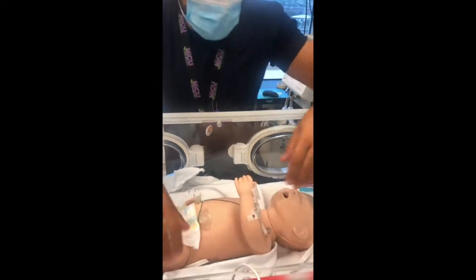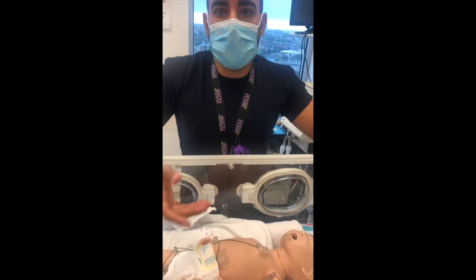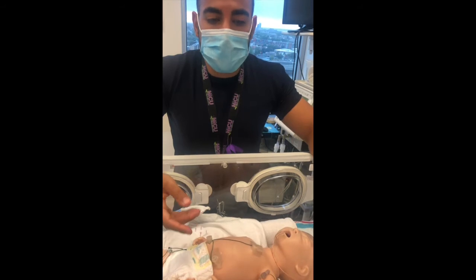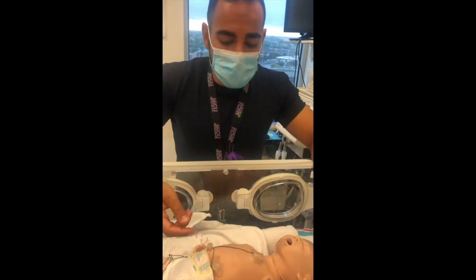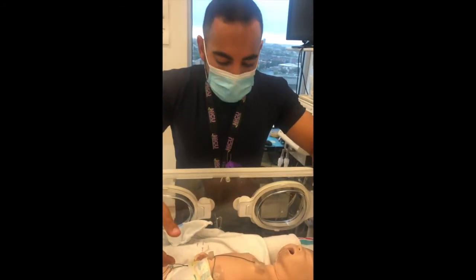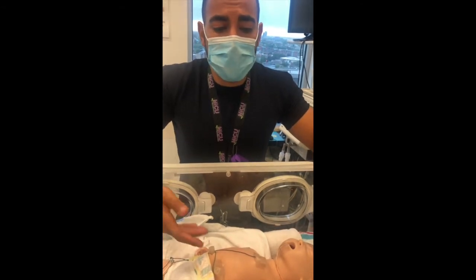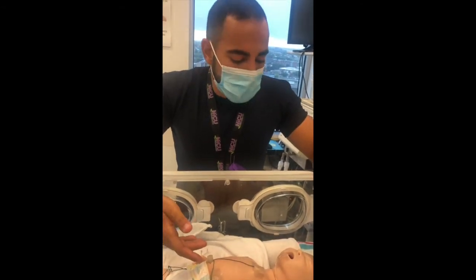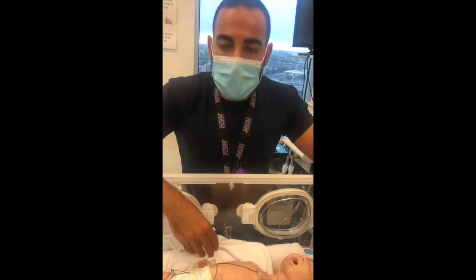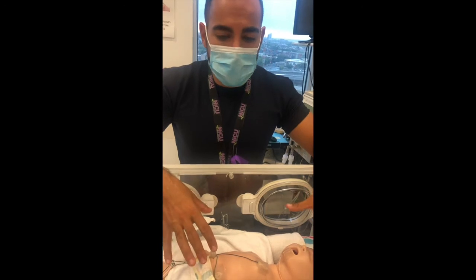These sensors need to be rotated every 12 hours and the skin needs to be monitored for irritation. Babies typically won't necessarily react to the sensor — it is not a burn, but there might be some pressure issues. That is why we want to relieve some areas of the skin, similar to what we would do with any saturation device — especially important for premature babies who are much more sensitive. By monitoring the skin regularly, we have not had any issues.